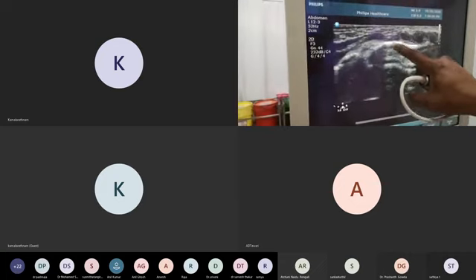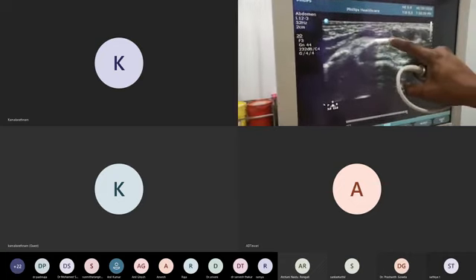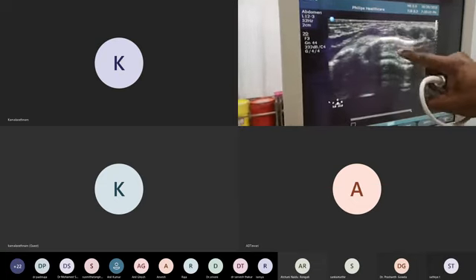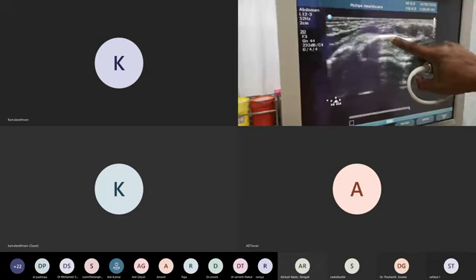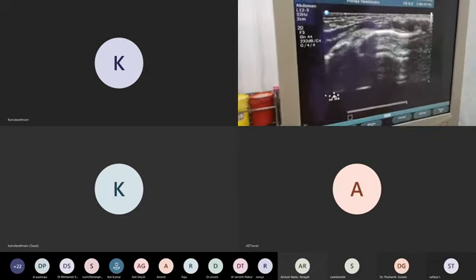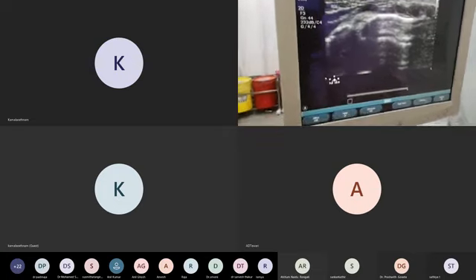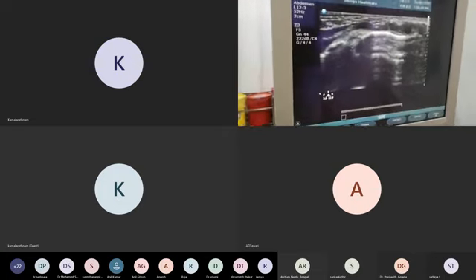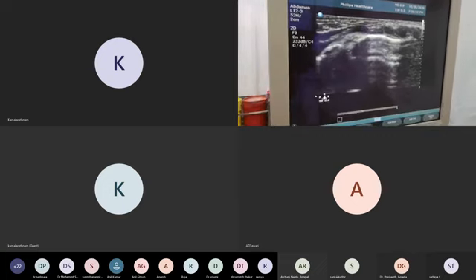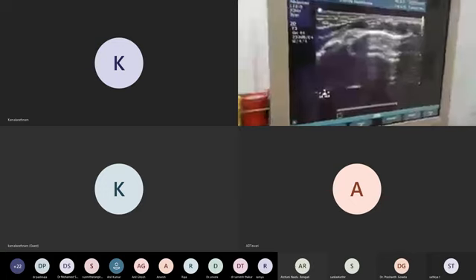Below the pleura, subpleural consolidation will start. Not after the pleura. Subpleural, below the pleura, in the lung, there is a consolidation here. You understood? Because, I told you, more surface, no place below to go. So that time that lung becomes wet. Subpleural consolidation. So everybody understood the pathophysiology. Then you will understand the ultrasound beautifully.